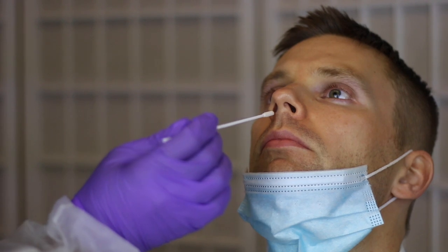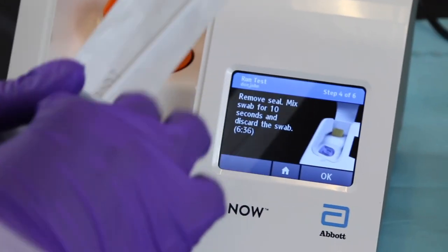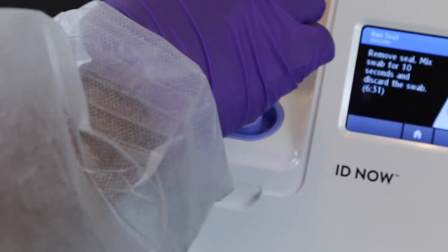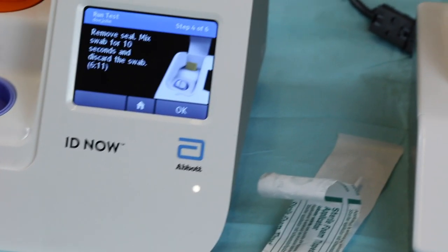Have the patient sit down and take three deep breaths to relax. Instruct them to tilt their head back and slightly lower their mask. Insert the swab until there is slight resistance and twist back and forth five times gently. Remove the swab and repeat in the other nostril when the patient is ready. Provide the patient with a tissue in case their eyes water. With the specimen collected, insert the tip into the well of the blue receiver and swirl for 10 to 12 seconds. Temporarily store the swab to the side — do not discard yet. If your test is invalid, you can reuse the swab on the next attempt.